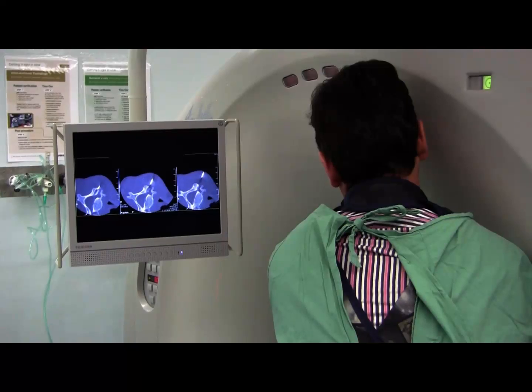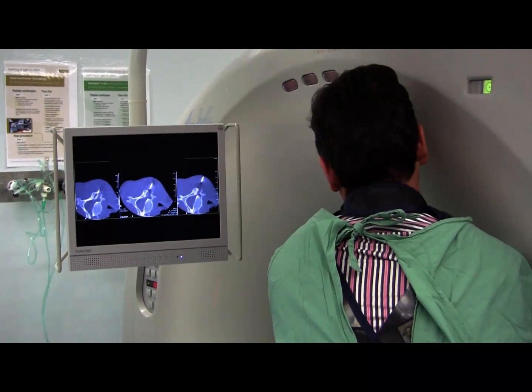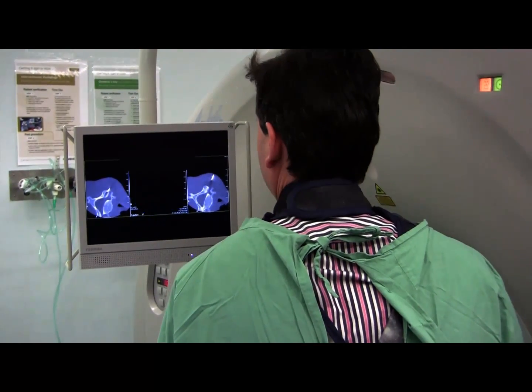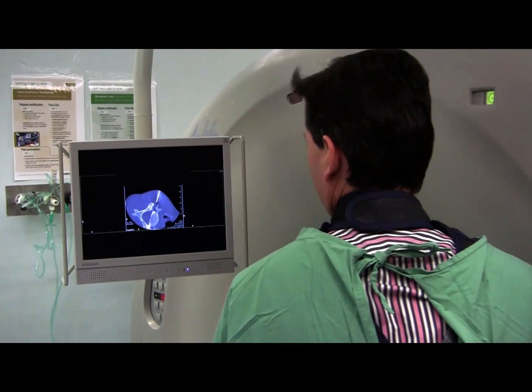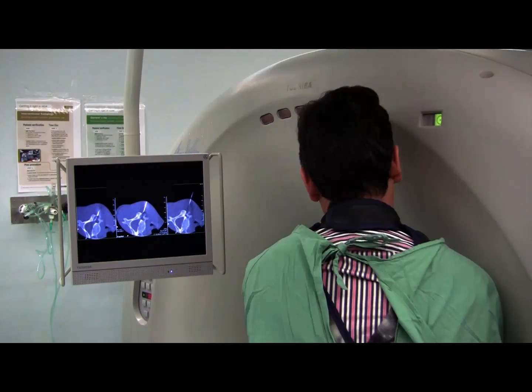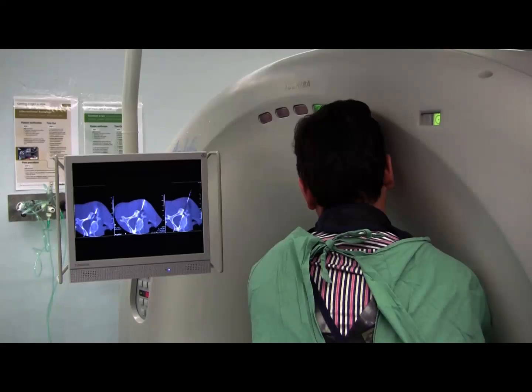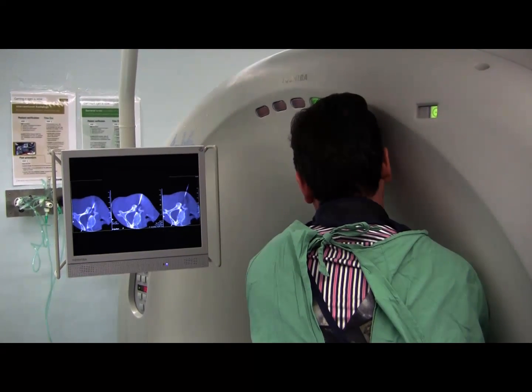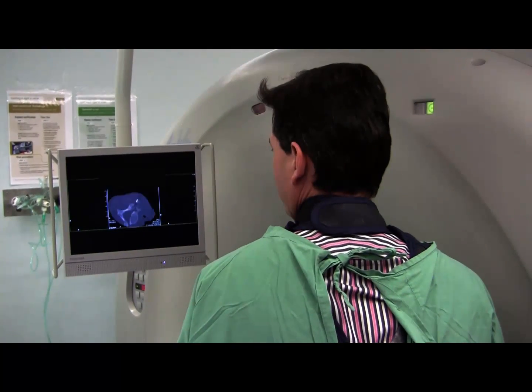It's important to get the needle tip to run as posteriorly along that intervertebral foramen as possible. We'll be moving the table up and down a little bit to see the course of the vertebral artery, to be sure that the needle tip is placed behind the vertebral artery, close to the nerve root, so that when we inject the Celestone Cronidose and Lignocaine we're confident we're not anywhere near that vertebral artery.